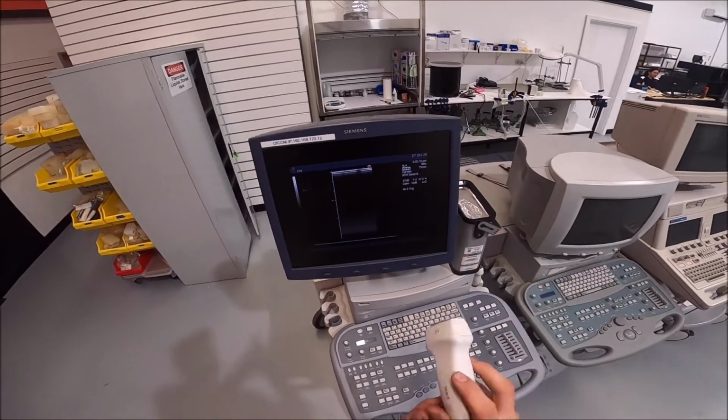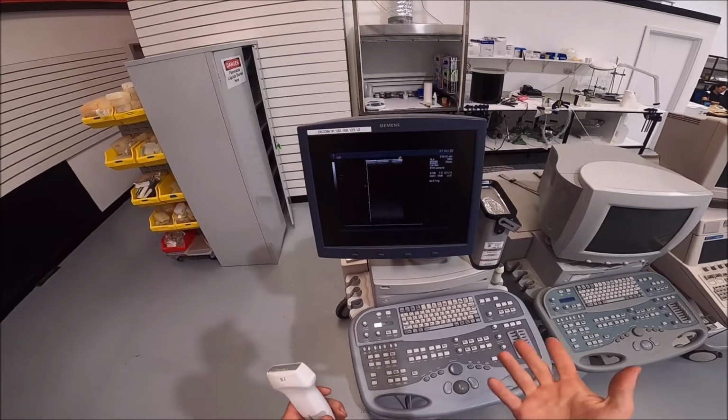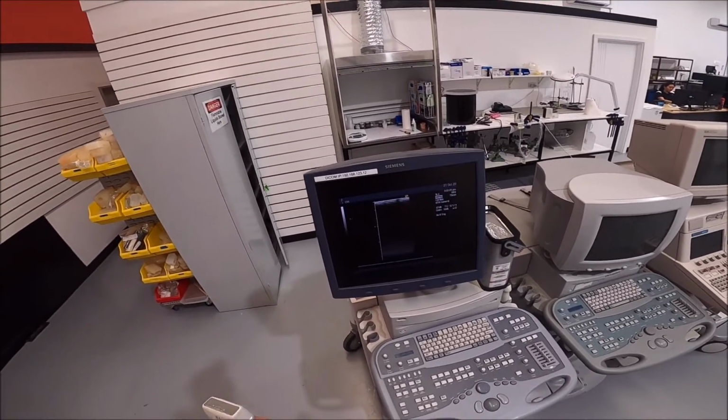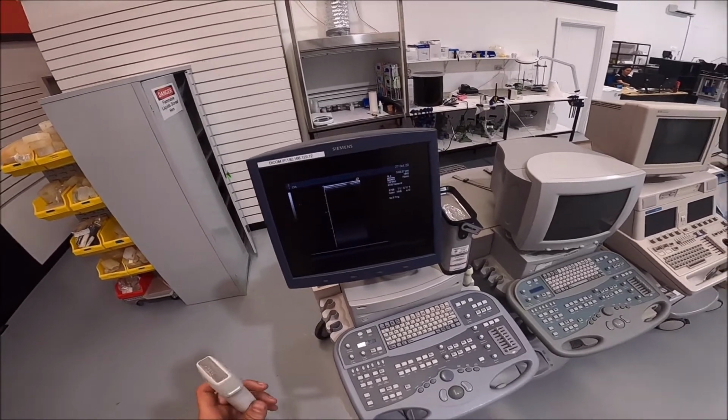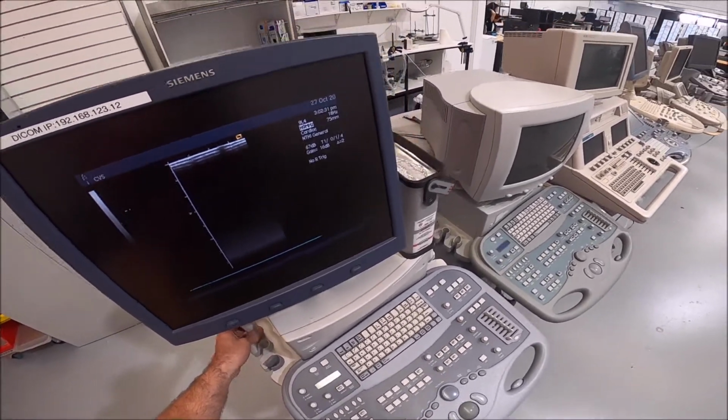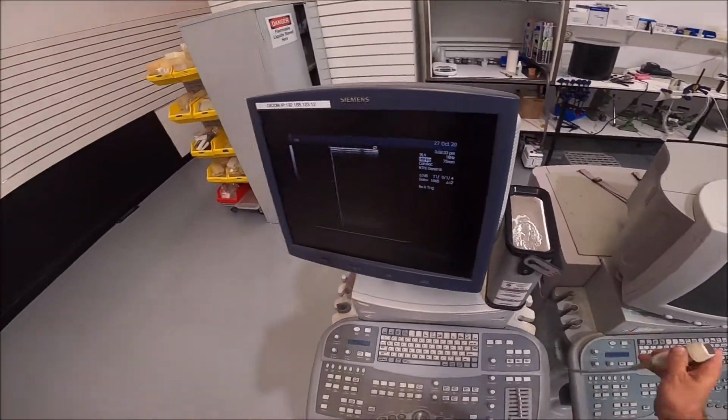Bear in mind though, that is 8 elements down, and yes, you can see it very clearly, but you might not easily identify one element down. So it just shows the value of acoustically testing all your probes. But now I'm going to show you exactly the same thing on a phased array probe.